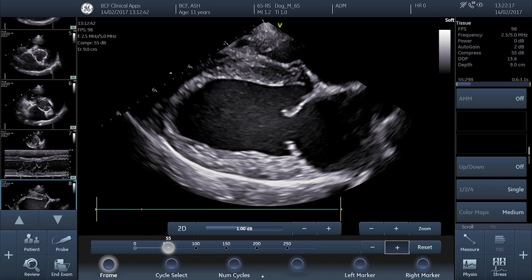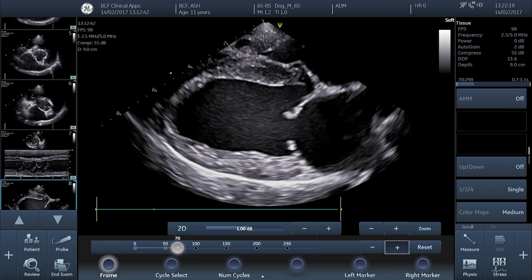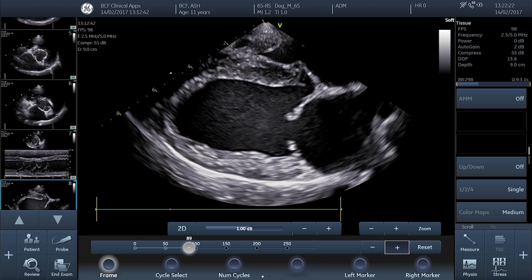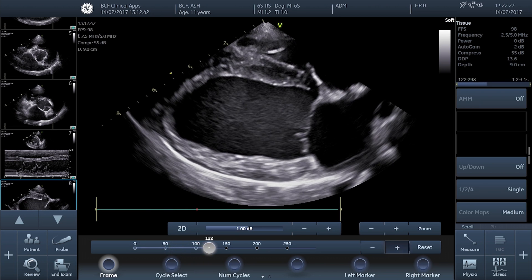The first thing we need to do is scroll through our stored cine loop to find the first frame in which the mitral valve is closed. This approximates to the end of diastole, when the left ventricle should be at its most dilated. If you're using an ECG, you can use the beginning of the QRS complex as your timestamp, but in the absence of an ECG, the first frame in which the mitral valve is closed is acceptable.